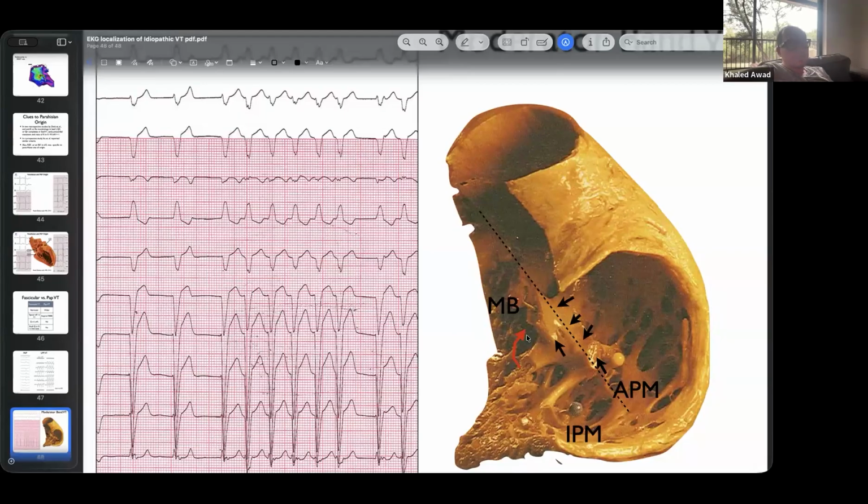And then I'm going to also reinforce the area around it, just a millimeter this way, a millimeter that way, put more applications there, at least 30 to 40 seconds in each spot. The ablation index, I think, is very helpful in the atrium. I don't know that it is super helpful in the ventricle. I just don't use it very much in the ventricle.